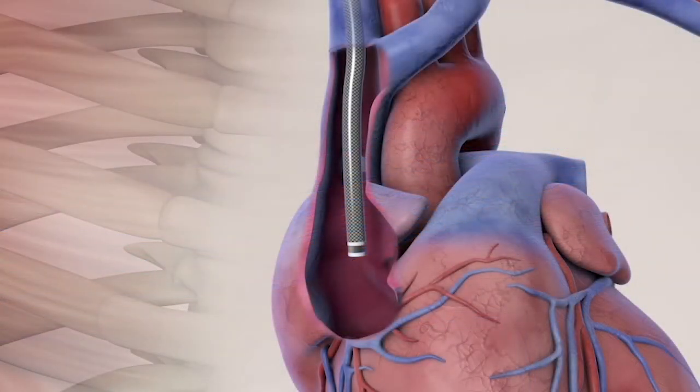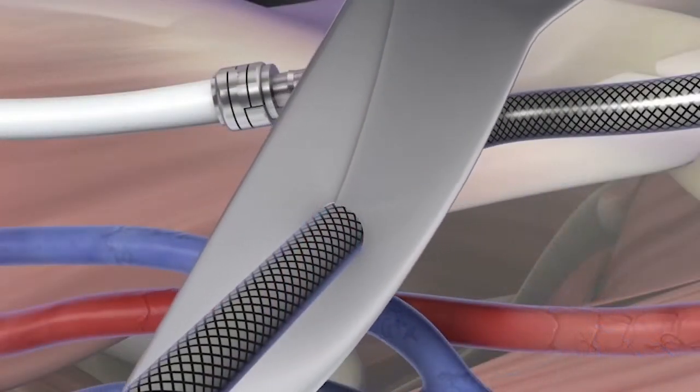Using fluoroscopy to confirm placement in the mid to upper right atrium, cut the venous outflow component to length.